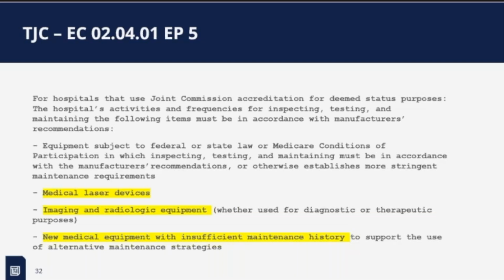A lot of people are just buying equipment to be the same type. So that's another strategy, to align your equipment. If you're a new hospital with money that can replace it with all the same types, great. Some hospitals don't have that. Some are getting hand-me-downs. And also, as you're getting rid of equipment, donate it to organizations that can use it.